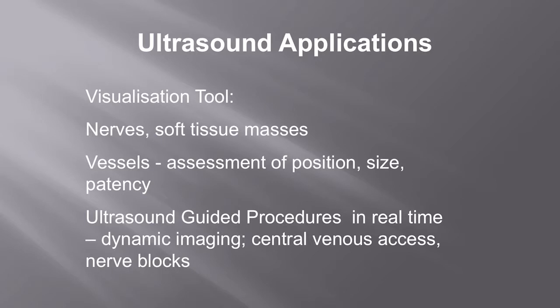So another thing that you can do, rather than wait for ultrasound to come in and get it done for you. All right. So, what are the uses for you guys in the ED? Well, you have a lot of ultrasound-guided procedures that one must do, all right?